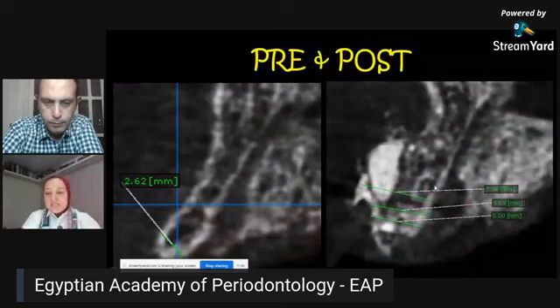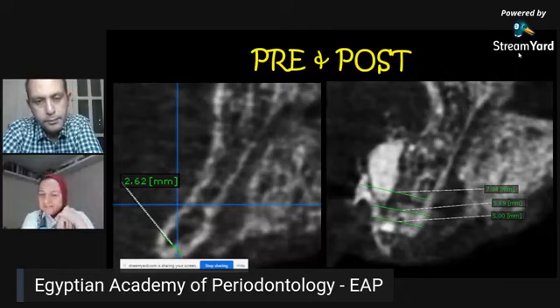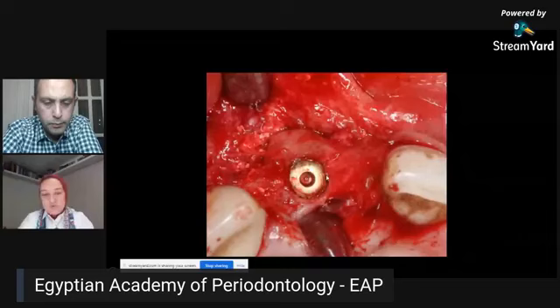Actually, when you look at this cone beam, you are really not sure if the block is integrated with the autogenous bone or not. I remember that when I saw this cone beam, I sent it to my professor, Dr. Hani Nahas, my supervisor. And I asked him, doctor, do you think this graft is not integrated? He just told me you have to open up and see. You can never tell from the cone beam. But actually what happened is that when we opened, it was well integrated and it was nice, and there was no problem with the drilling or anything. And you can see here the buccal contouring and the amount of gain we had.